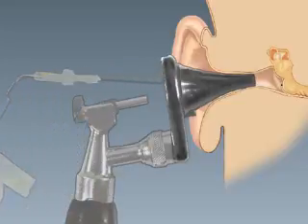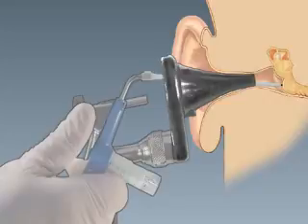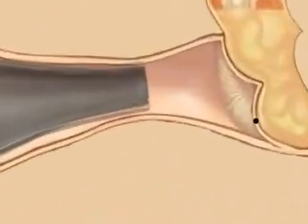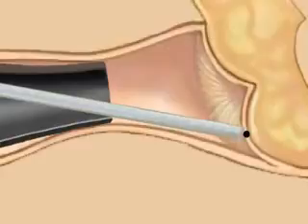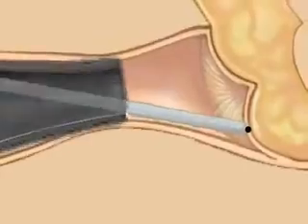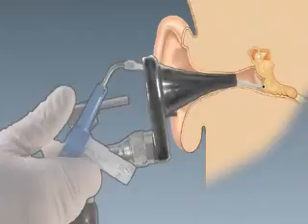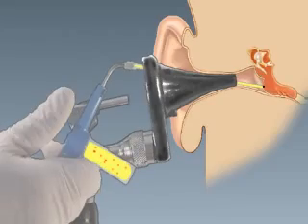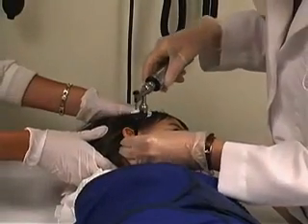Use a second tympanocentesis aspirator with a flexible catheter to suction any remaining pus from the middle ear. Insert the catheter through the speculum and place it over the opening in the tympanic membrane made by the needle. The catheter should not go through the tympanic membrane. This step also clears the debris in the external auditory canal and may enhance visualization of the tympanic membrane at future visits. The steps of the procedure are as follows.